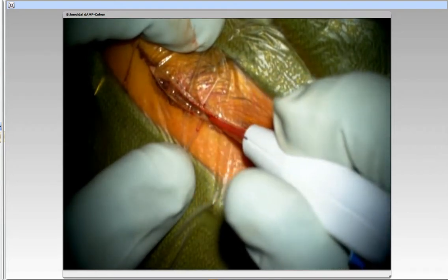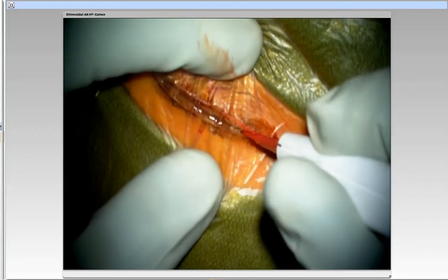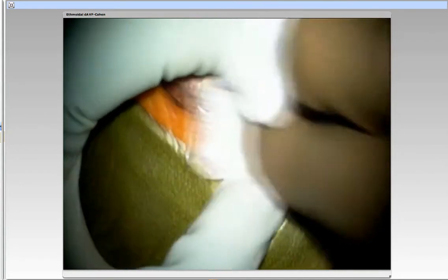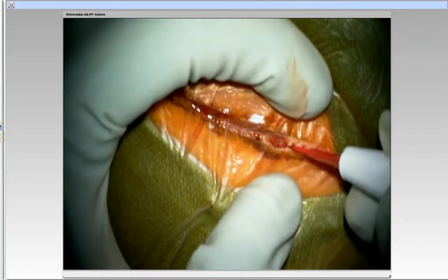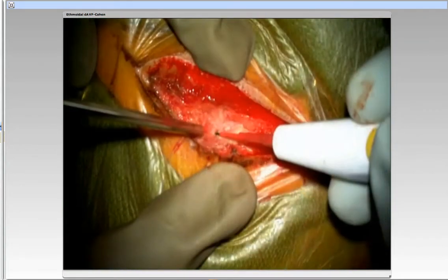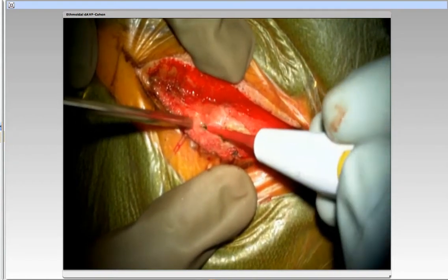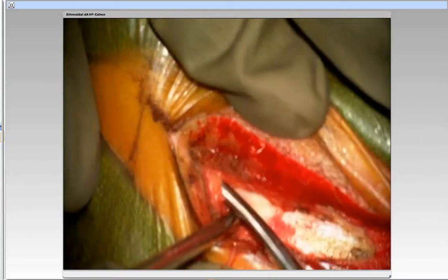Do you like this approach for these lesions? I think this is a very reasonable approach, particularly for the gentleman's hairline. It's not one I typically use, but for the hairline, I think it's very reasonable. I appreciate it. So you would have considered this in this situation because of his hairline? Yes.